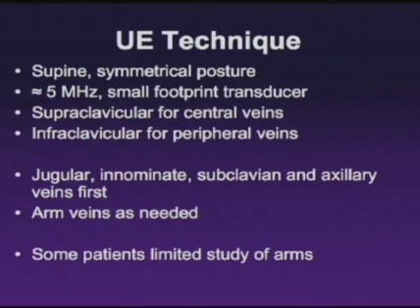In some patients who have clear-cut arm abnormalities, such as patients who have arm swelling following an intravenous catheter placed peripherally, we might limit the study to the arm alone. But for the vast majority of patients who are evaluated for DVT, the central veins are evaluated as well as the arm veins.